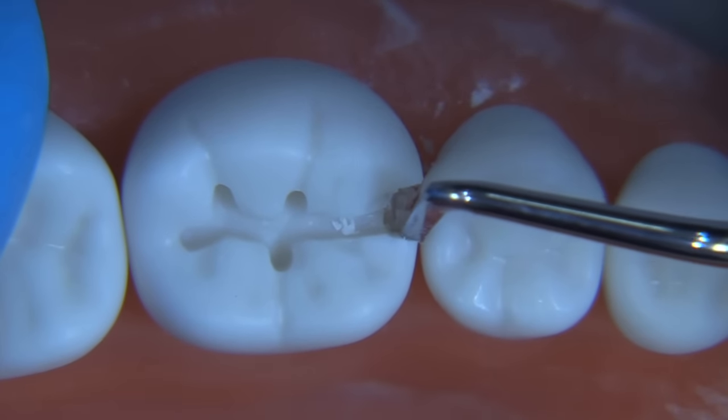This is the 330 RGS. The bur is not intended to start your preparation — some students try to use it to cut the entire prep but it just doesn't work. It's mainly for refining. You can see the 330 RGS is two millimeters in length versus three millimeters for the 245, and it has a much flatter bottom. Here's the 330 regular versus the 330 RGS: the 330 RGS has a flat bottom, it's convergent, and it has a little blue stripe so you can easily remember which bur it is. I'm going to bring up my iPad and do a little sketching.